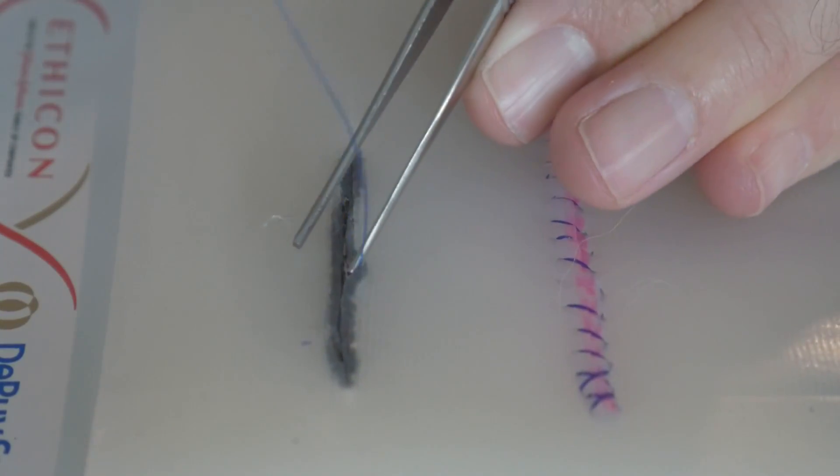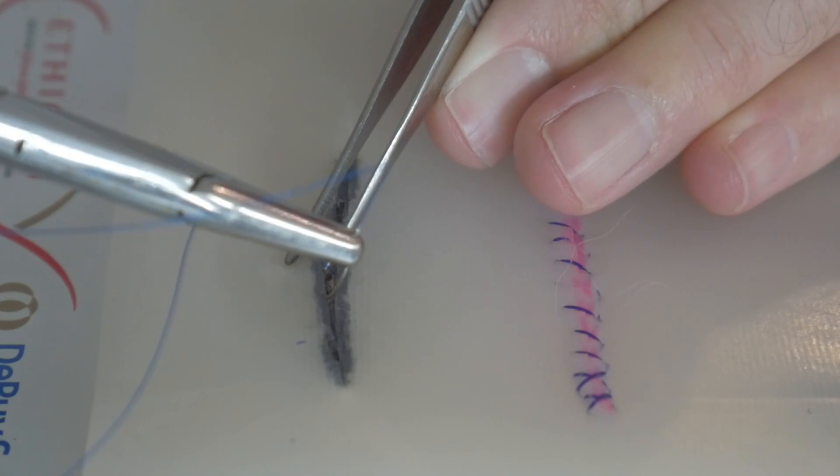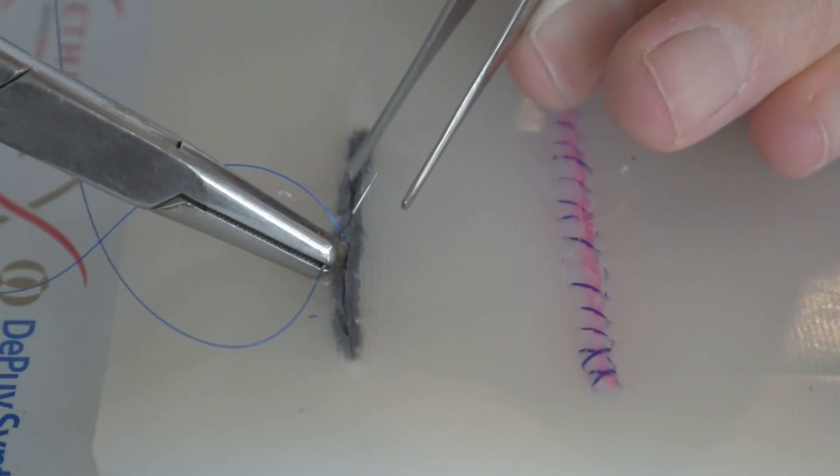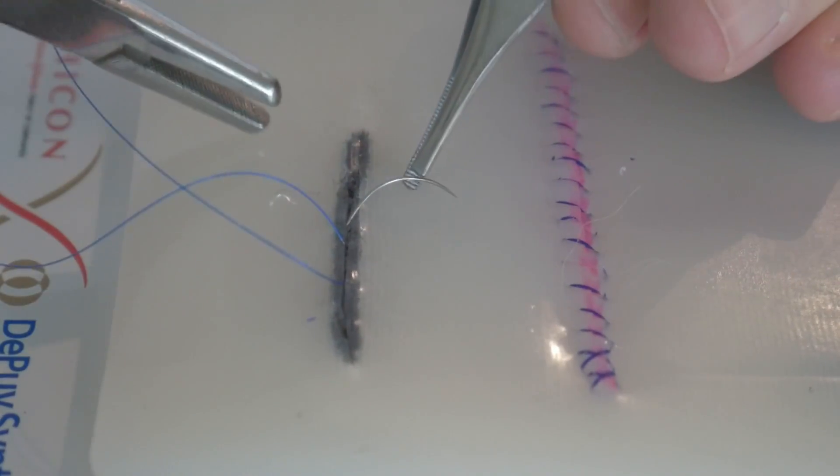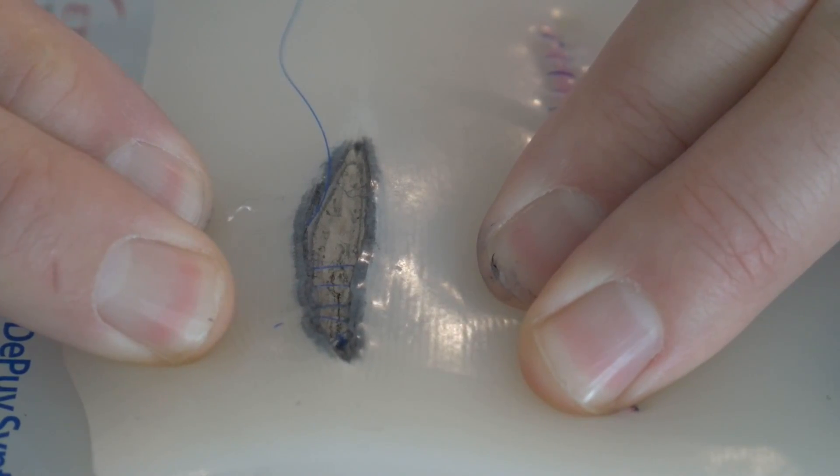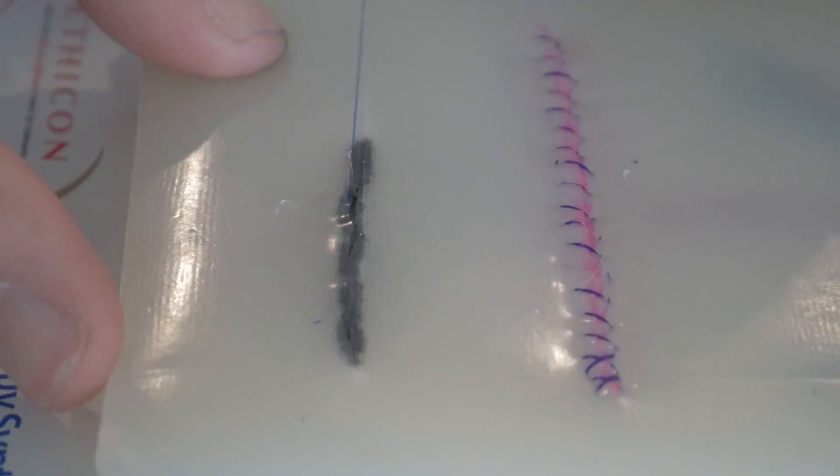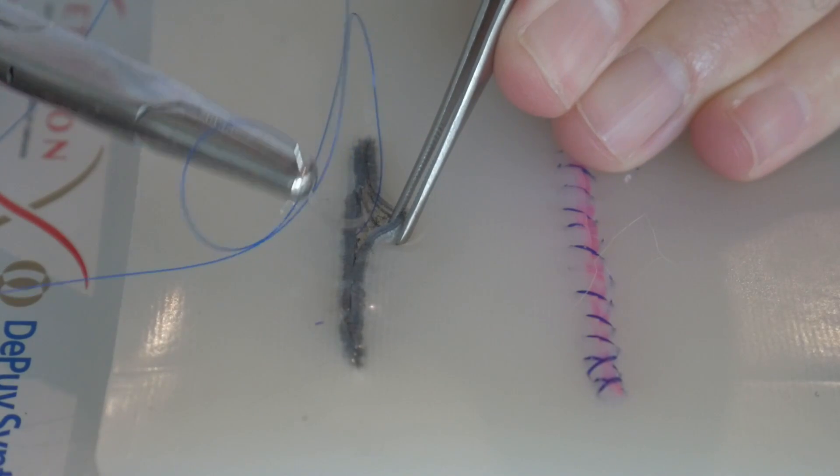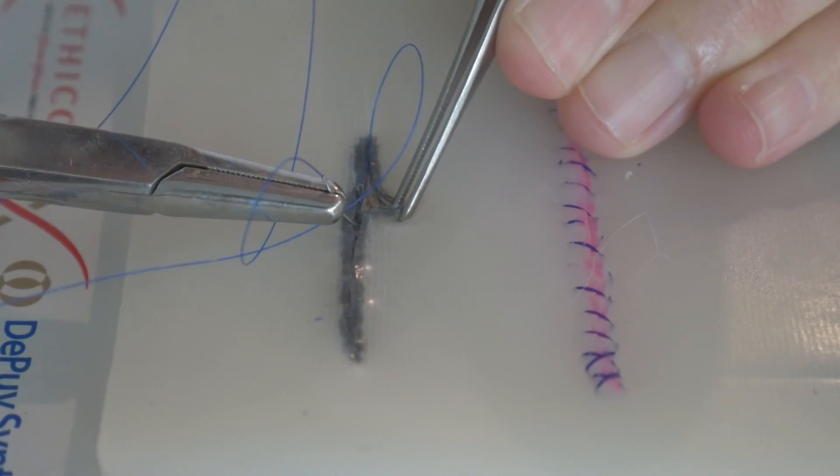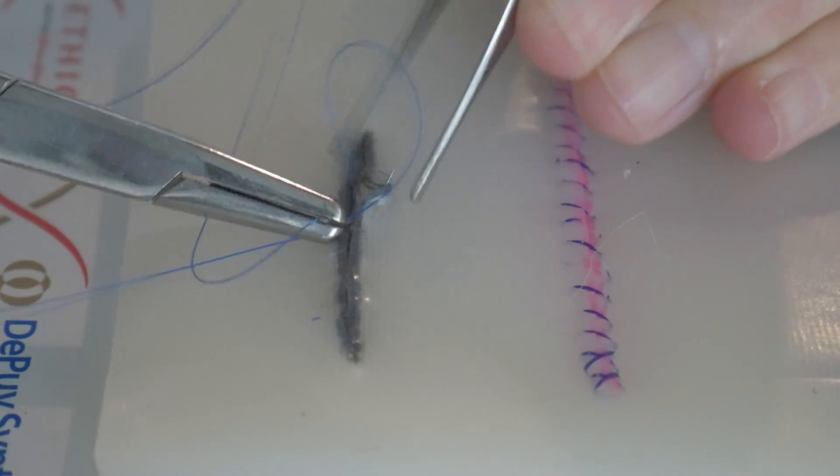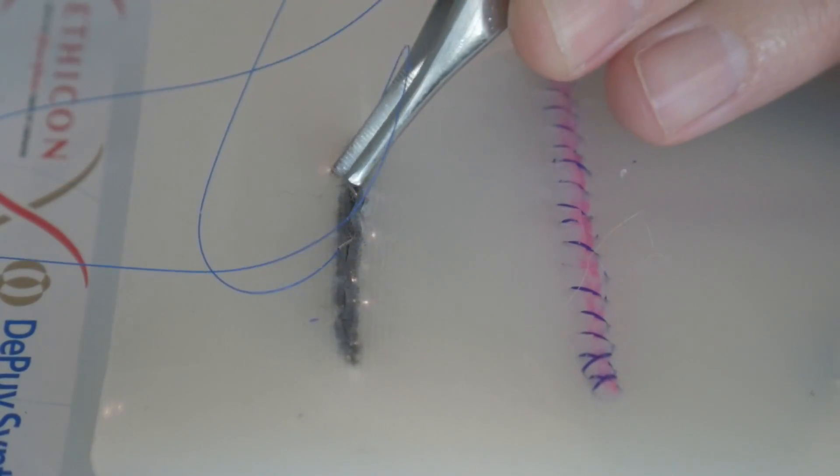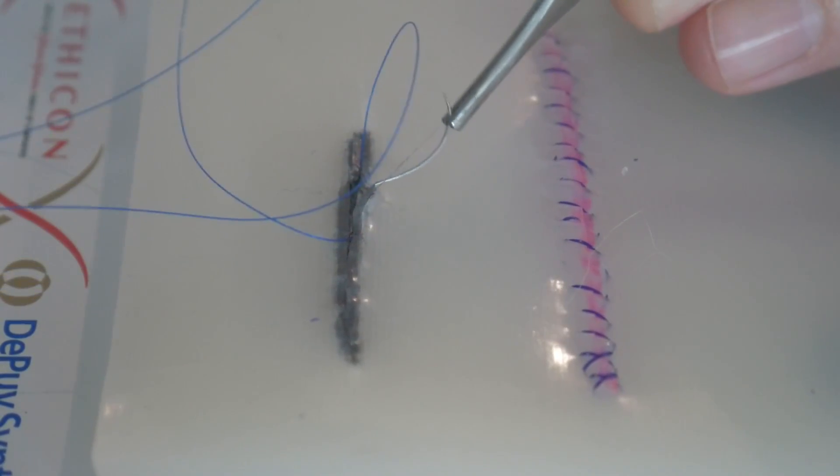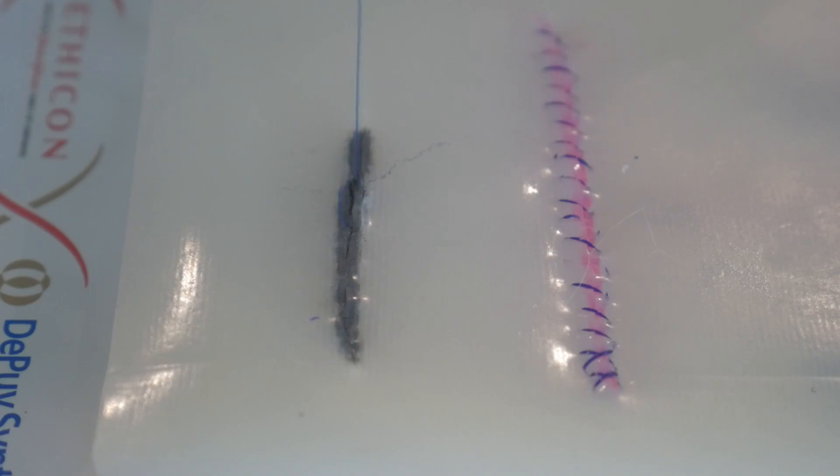If you travel too far back on every bite, those stitches as they're coming across the incision might look like they're at 45 degree angles or 25 degree angles or something like that. And it's going to kind of skew the incision as you close it. It might look like instead of the incision closing in a straight line, it may look more squiggly. Honestly, it doesn't really matter in the long run anyways. Once the sutures end up absorbing and the incision kind of takes its time to even itself out, it'll end up looking like a straight, perfectly closed incision anyways.